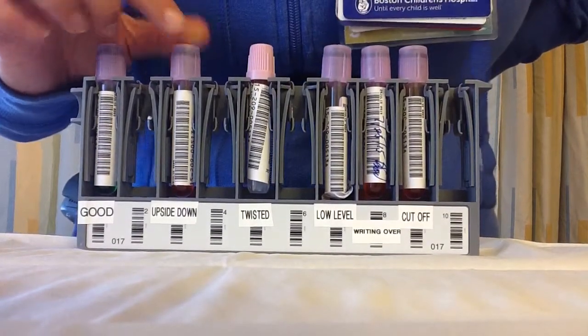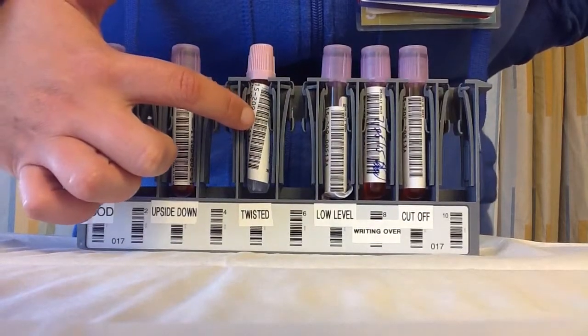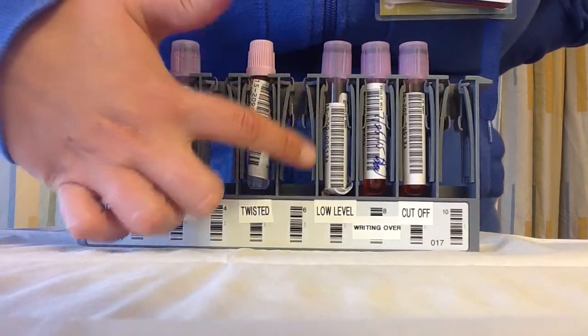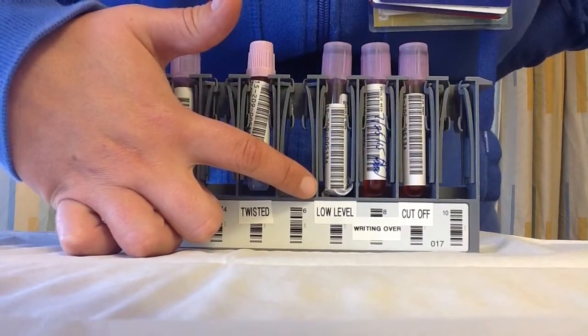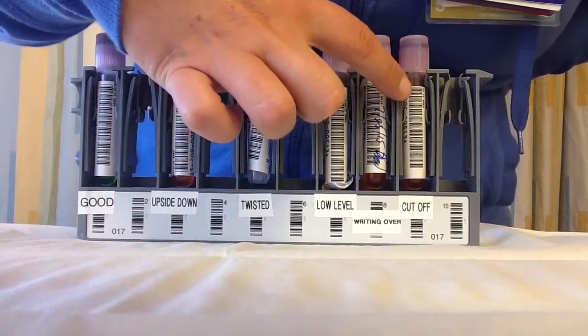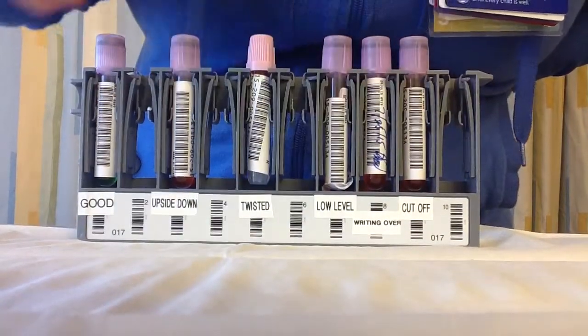These are some common labeling mistakes we make when sending tubes to lab: the barcode could be upside down, the label could be put on twisted so you can't read the whole barcode, the label is too low and cut off on the bottom, there's writing over the barcode so it can't scan, or the label as printed was cut off and the barcode was cut off.